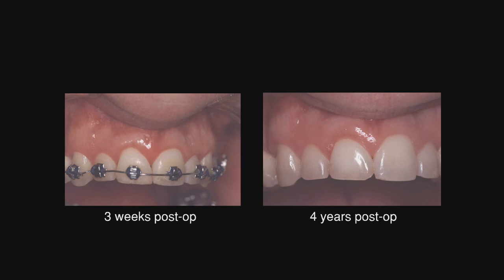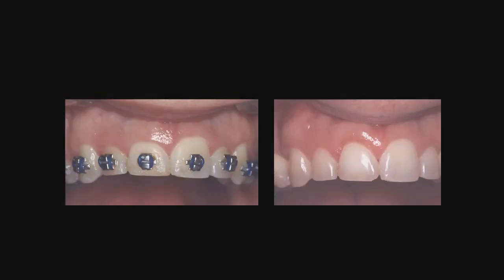So now let's look at the tooth 4 years post-op. You'll notice there's a little chip here where the patient continued to play rugby and fractured the tooth again, but we can see the amount of rebound that has taken place on number 8 because we did sever the attachment. It's only 9.5 millimeters long compared with 11 millimeters on the other central. But the amount of aesthetic improvement was satisfactory to the patient. So here we see where we started, and now we see the difference 4 years later.